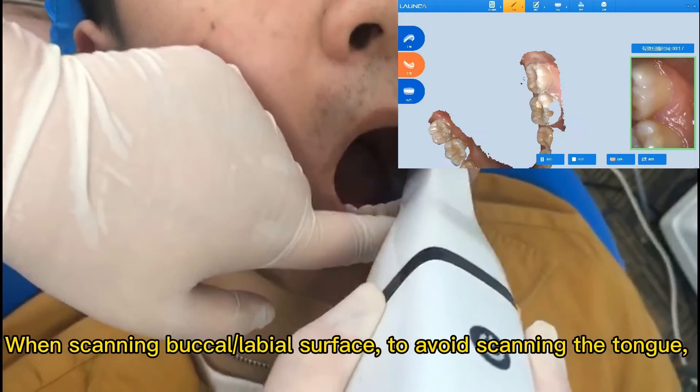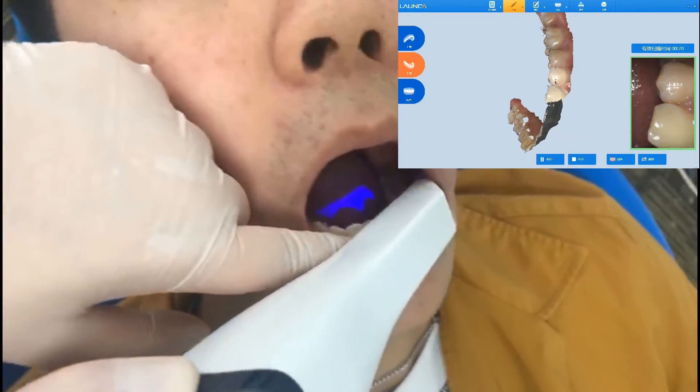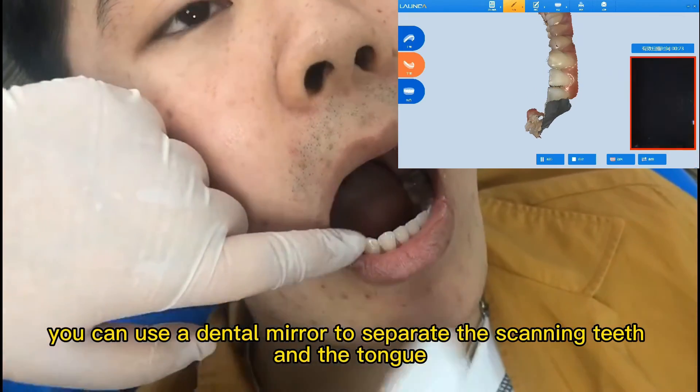When scanning the buccal and labial surface, to avoid scanning the tongue, you can use a dental mirror to separate the scanning teeth from the tongue.